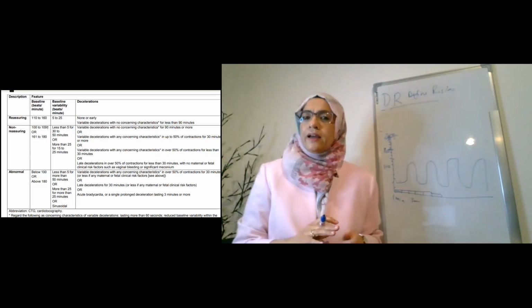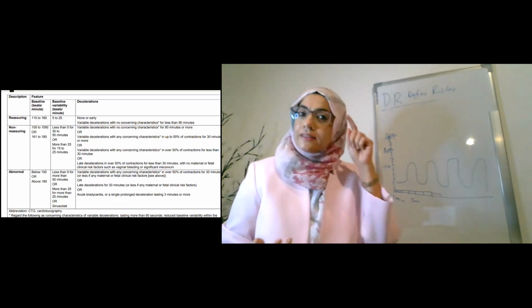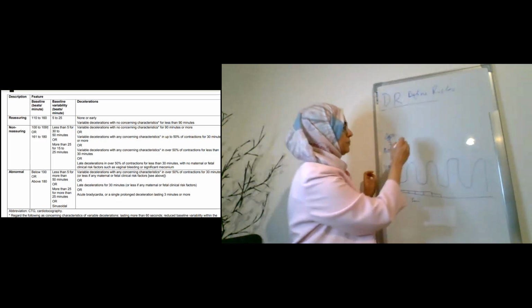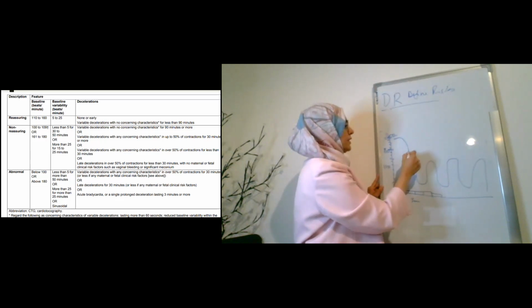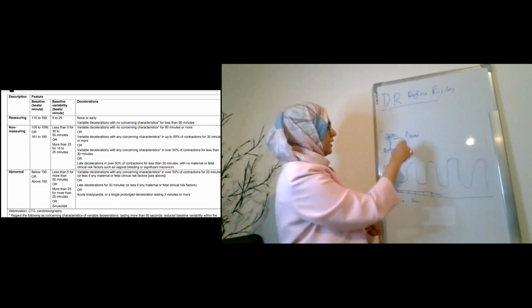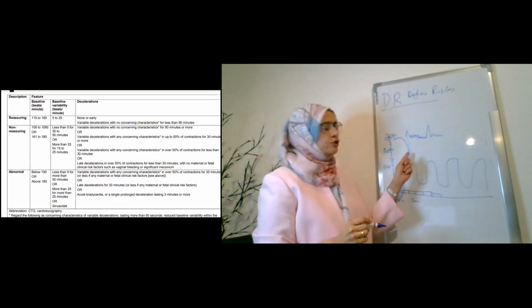And the more they have strange shapes, the more you start getting worried. And then remember the swimming baby analogy, it will help you. So let's start. So we have a baby whose heart rate goes down, and then it quickly picks up and says, no, I'm fine, mommy, I'm fine. I had a decel, but I'm okay. And it keeps happening. So you're not too worried about it.